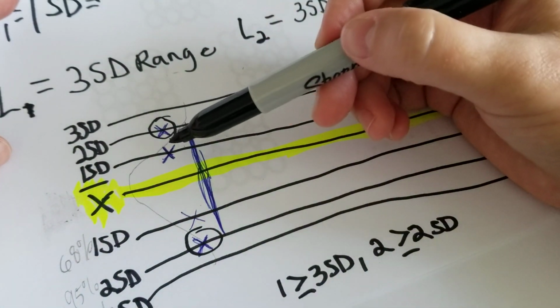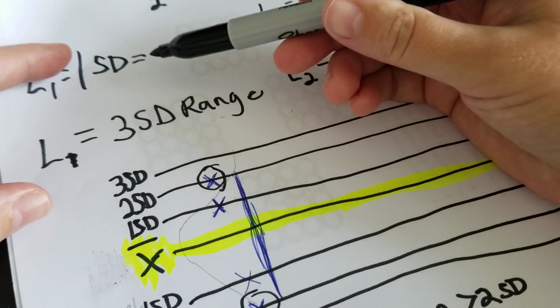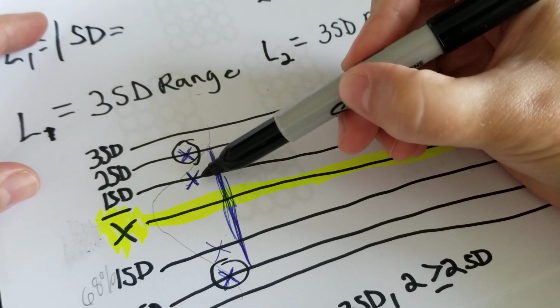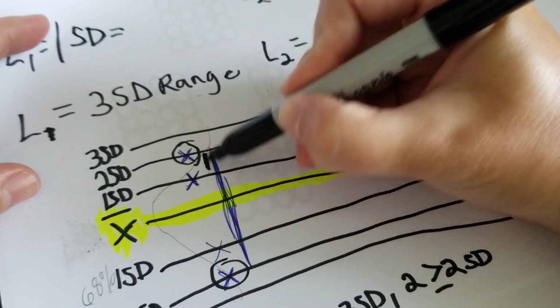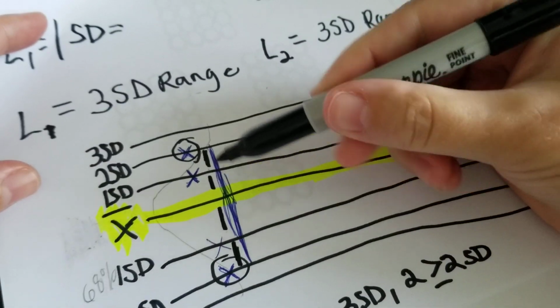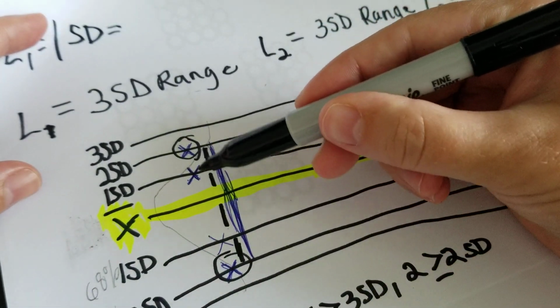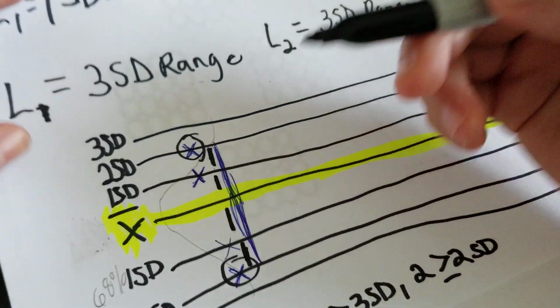So in order to know how to figure out what 1 SD is, we have to mathematically use what we know. And we also are noting that in between each of these little spots, there's 4 spaces in between each of these spots, okay? 2 away from the mean on the upper side and 2 away from the mean on the bottom side, all right?